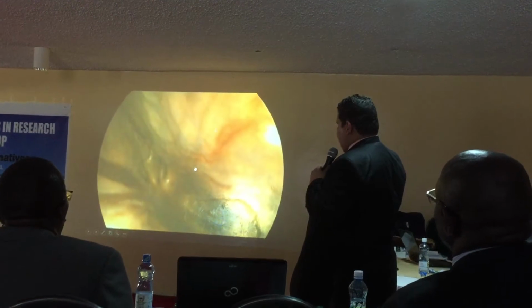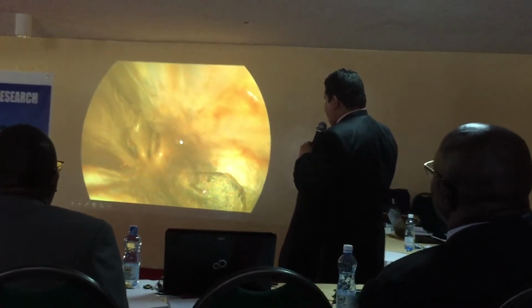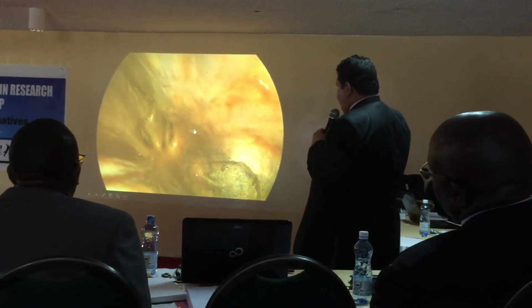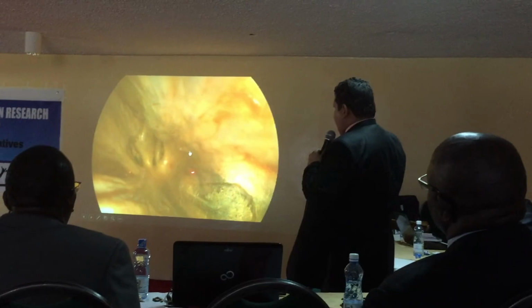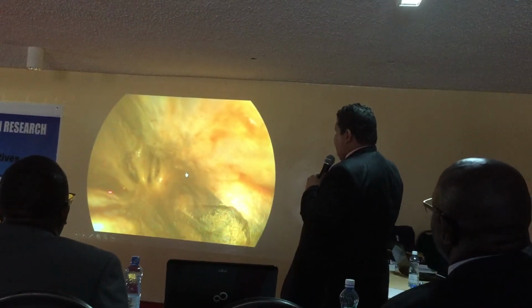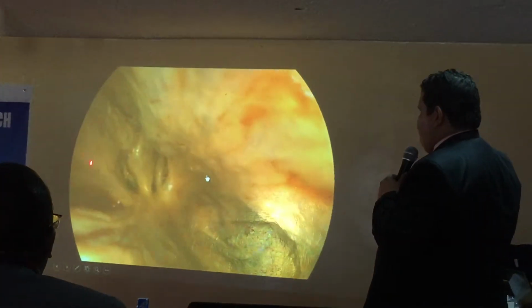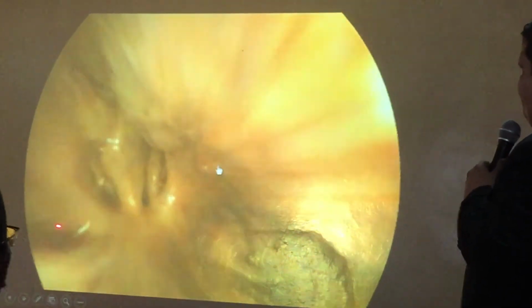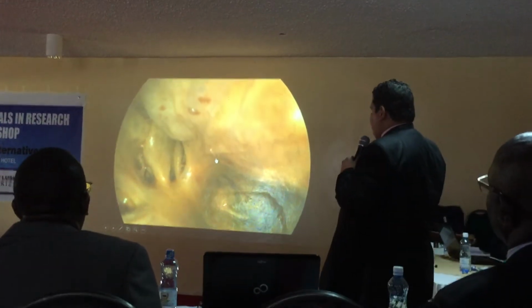This is the nasal septum, dorsal conchae, ethmoid turbinate, and larynx. Cartilaginous flap opening of the guttural pouch, dorsal pharyngeal recess, and the nasomaxillary sinuses communicate with the paranasal sinuses in adult horses. With sinusitis, there may be mucopurulent discharge here, because it communicates with the paranasal sinus.